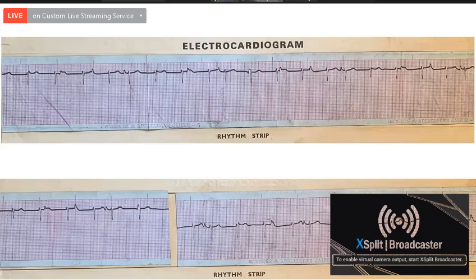Sir, the rhythm strip is showing an atrial rate of 74 beats per minute, with a ventricular rate of 80 beats per minute, sir, with intermittent conduction of atrial to ventricular conduction. Okay. So the atrial rate is around 74, 75 and yes, the ventricular rate is around 80, 81.